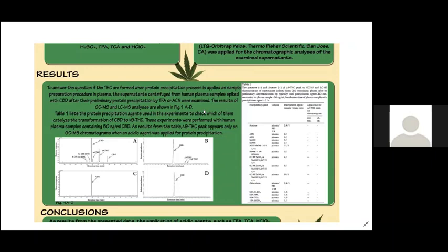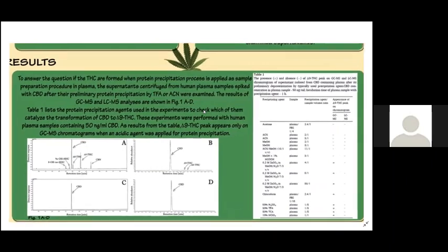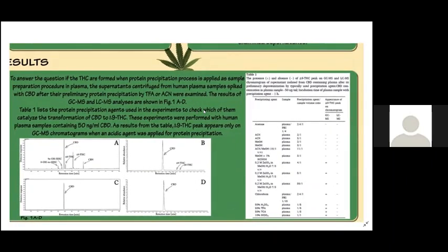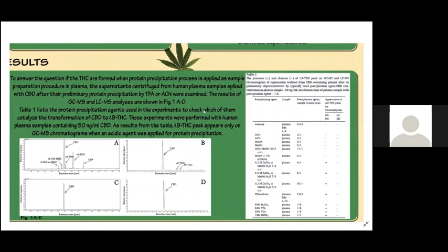The use of acetonitrile in LC-MS analysis also does not generate derivatives, figure 1D. Table 1 lists the protein precipitation agents used in the experiments to check which of them catalyzed the transformation of CBD to delta-9-THC. These experiments were performed with human plasma samples containing 50 nanograms per milliliter CBD. As results from the table, delta-9-THC peaks appear only on GC-MS chromatograms when an acidic agent was applied for protein precipitation.